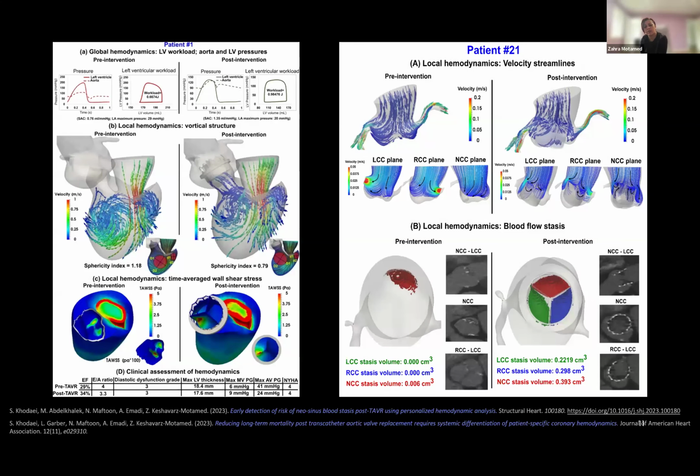We believe that we should also quantify cardiac function metrics. So we also investigated vortex flow and intraventricular fluid dynamics, not as precisely as we did for left ventricular workload, because that is more intensive, but we also worked on it significantly. And we realized that even for intraventricular fluid dynamics, in the same population, 10%, 50%, the situation got worse. So we checked vortex metrics and also wall shear stress, different fluid dynamics indices that even clinicians introduce, and we proved that this is a case that should be investigated.